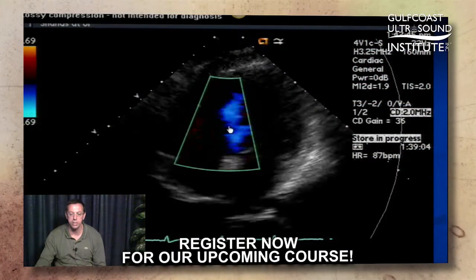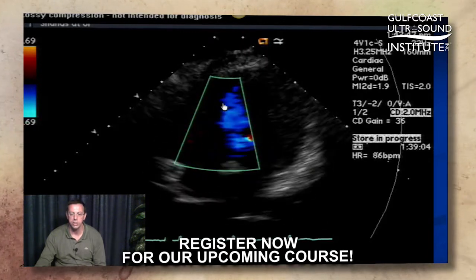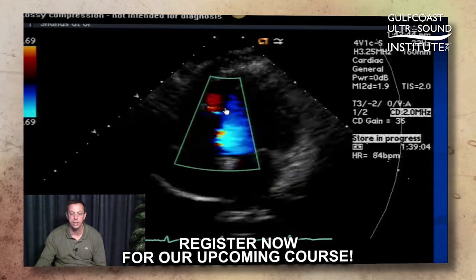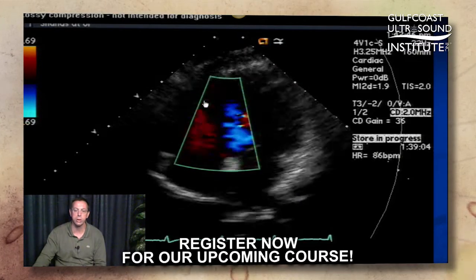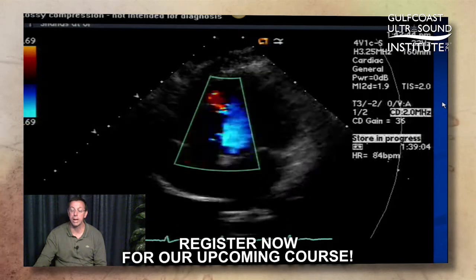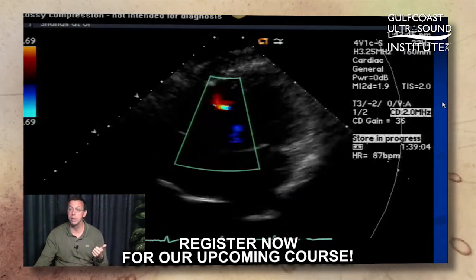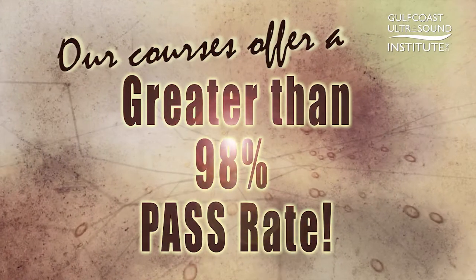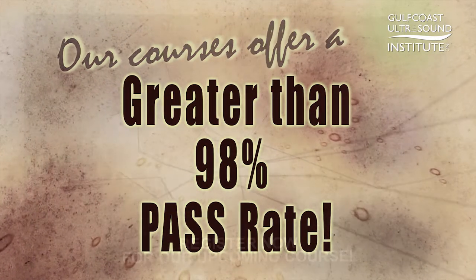In the next picture you'll see some color aliasing in the septum. This is a patient who had a ventricular septal defect post-MI — the area of muscle necrosed and ruptured right through here, creating a VSD. When you hear someone say they have a new systolic murmur after an MI, it's one of two things: papillary muscle rupture or VSD.